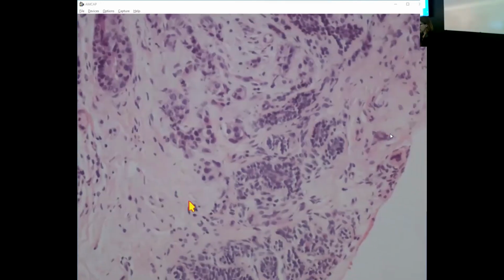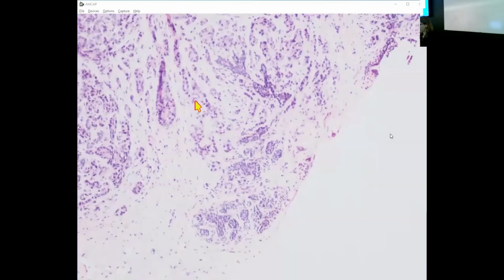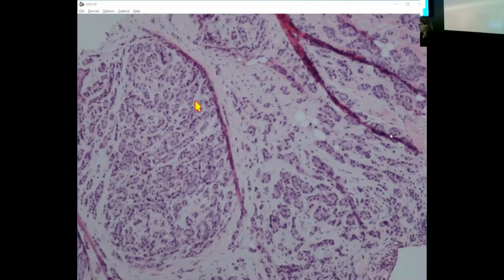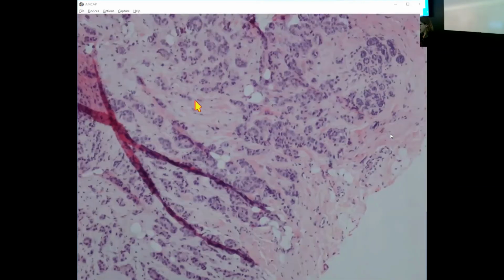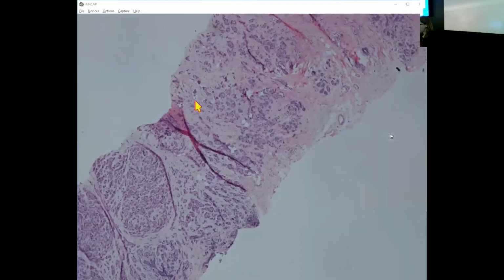So when you start to look at the cytology, this is your normal epithelium, and this is your atypical epithelium. And then as you go back and look at low power again, now it's sort of beyond those lobular-centric areas. You've got these nests just haphazardly growing throughout the core biopsy.